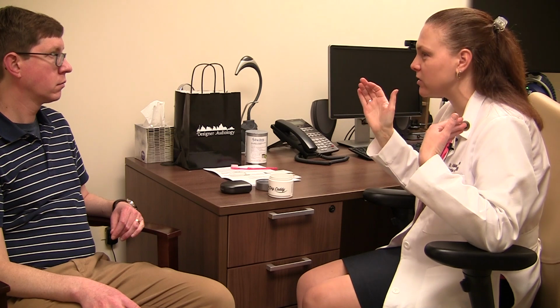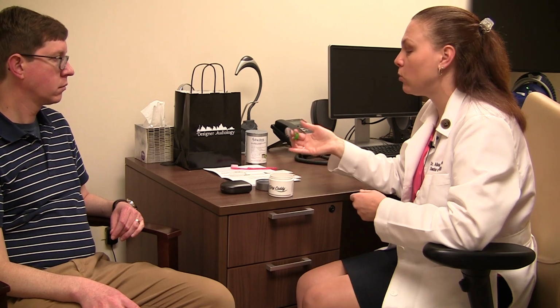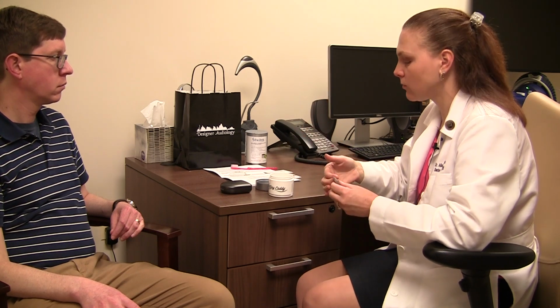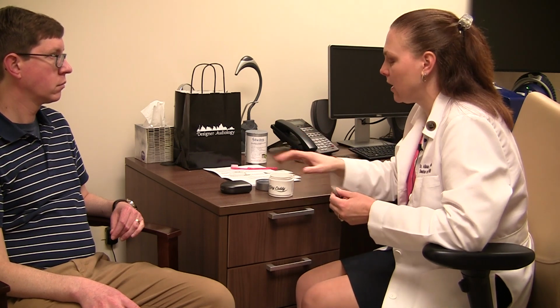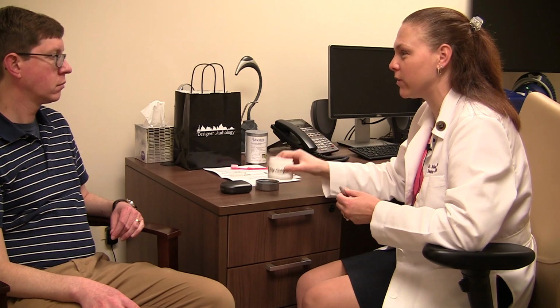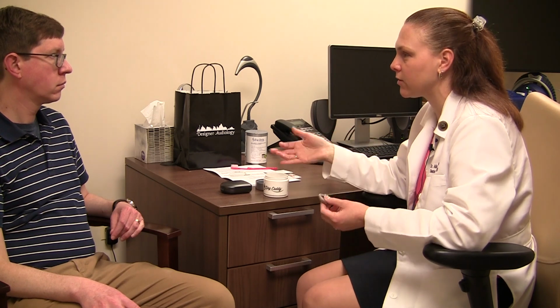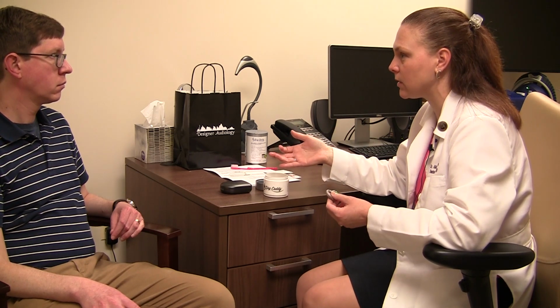In the morning, get up, take a shower, wash your hair, put on any type of makeup, aftershave, whatever you might do in the morning. The hearing aids are going to go on last. We want to make sure that none of that artificial stuff that we're putting on our skin or on our hair gets onto the hearing aid itself. When you take the hearing aid out, I want you to clean it. And the reason why we clean it in the morning is because it's been in your dryer overnight, so any wax, dirt, skin, hair, whatever, it's all going to be dry and it's very easy to clean.